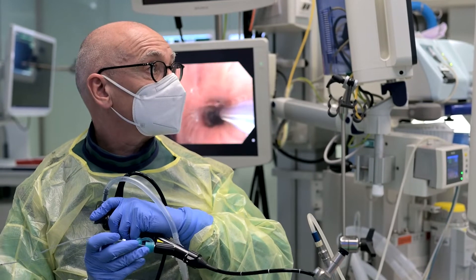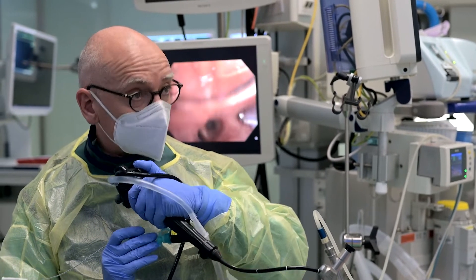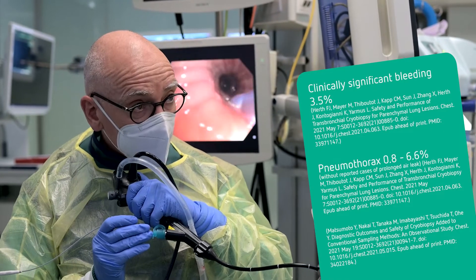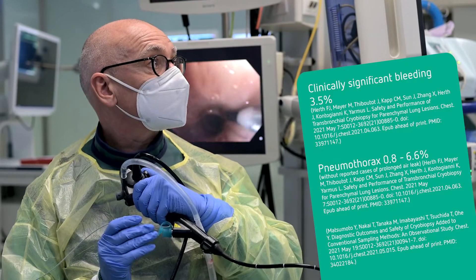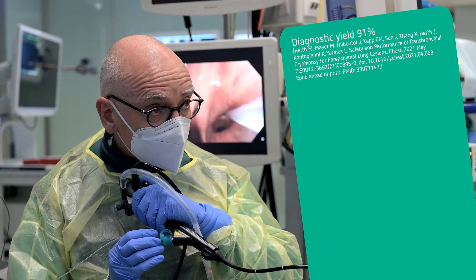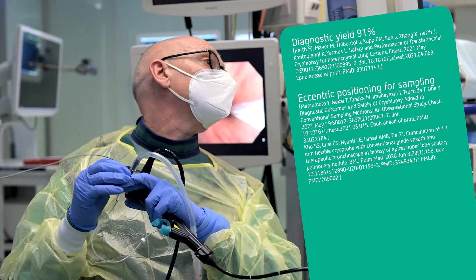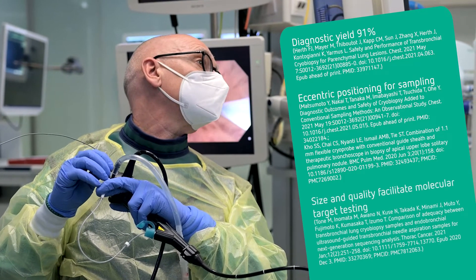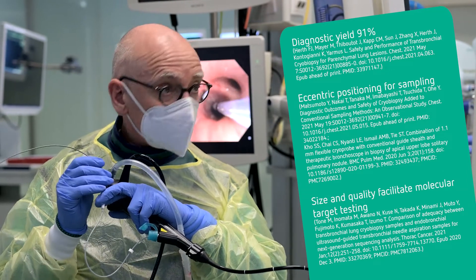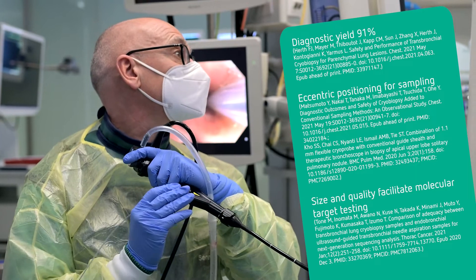Different bronchoscopic tools for peripheral sampling are available. These include brush, needle, forceps, bronchoalveolar lavage, and flexible cryoprobes. For cryobiopsy, a safety profile comparable to that for forceps was demonstrated in large multi-center cohort studies. The diagnostic yield was reported to be as high as 91%. Successful sampling, even when the cryoprobe was positioned eccentrically, contributes to this high diagnostic yield. Lesions with a positive bronchus sign on CT scan were associated with a higher likelihood of a diagnostic sample. Sample size and quality have been reported to deliver a large amount of tissue eligible for molecular target testing.